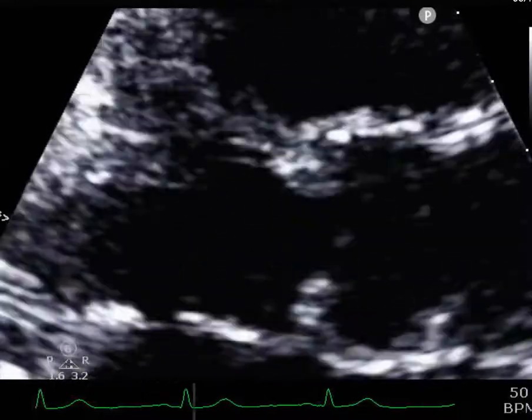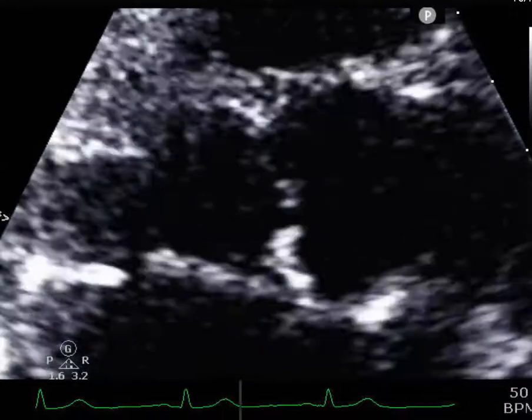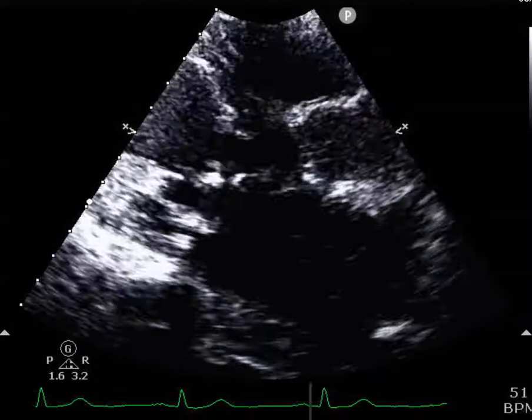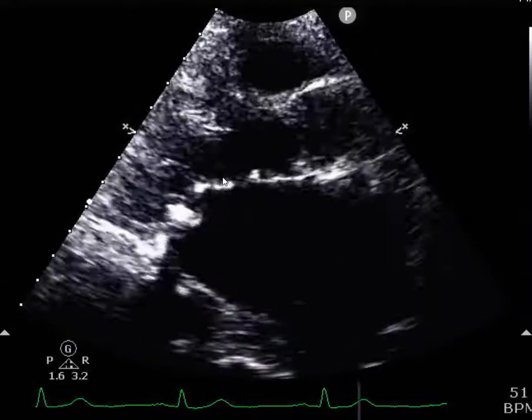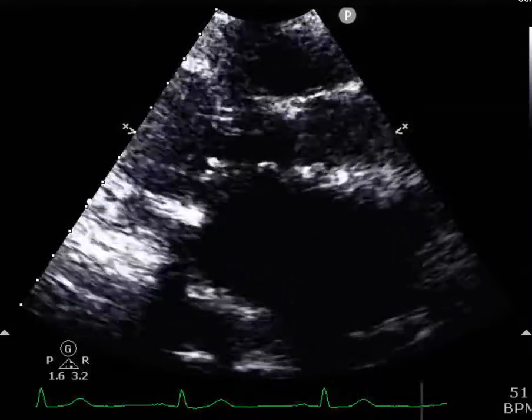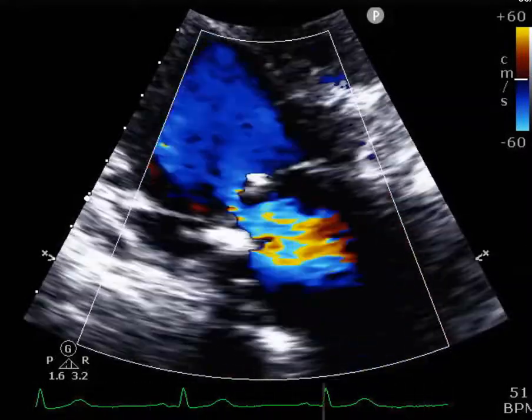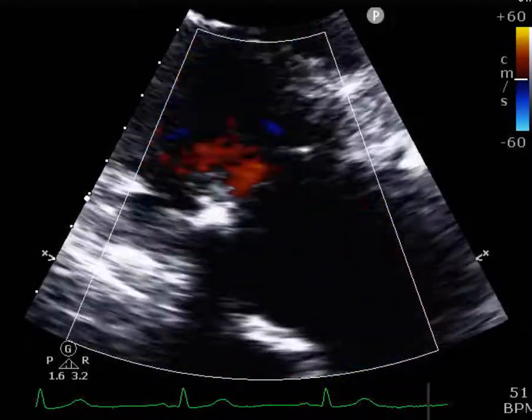Going forward, here is the aortic valve in long axis view. It looks like it's opening well. There's some calcifications, however. And moving ahead to the mitral valve here on long axis view, calcified, opening well. The posterior leaflet does look a little bit restricted. And here is the mitral regurgitation. I always find that the parasternal long axis view often underestimates the severity of the regurgitation, so I anticipate that it's going to be actually a little bit more later on.